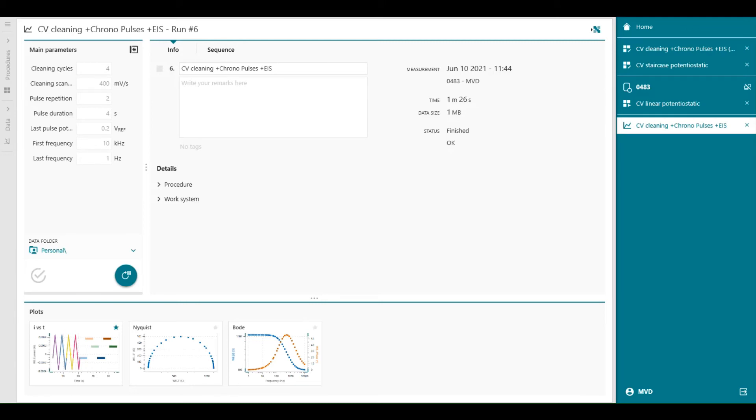It is also possible to work with more than one vionic instrument at a time from the same Intelo view. When we have multiple work systems claimed, we get more sections in the panel. Let's see how that looks. We go to home.